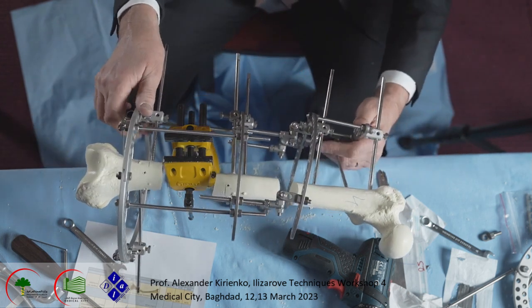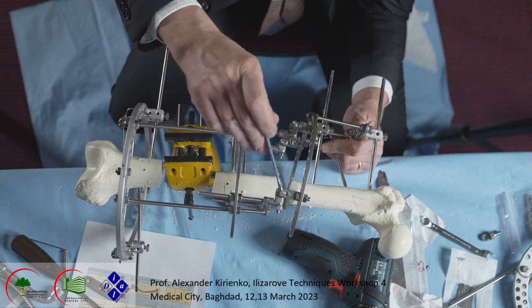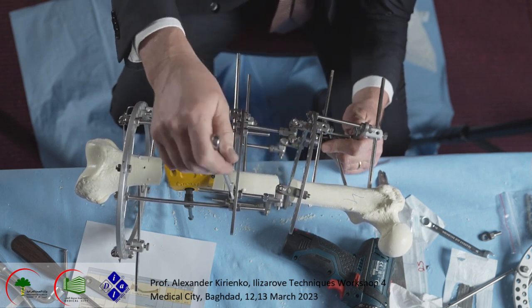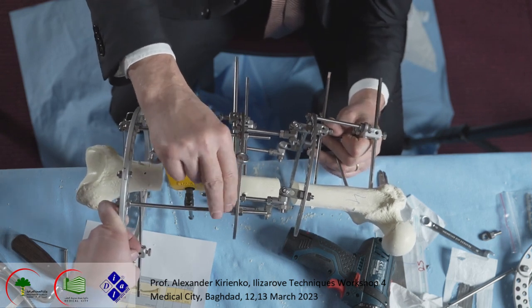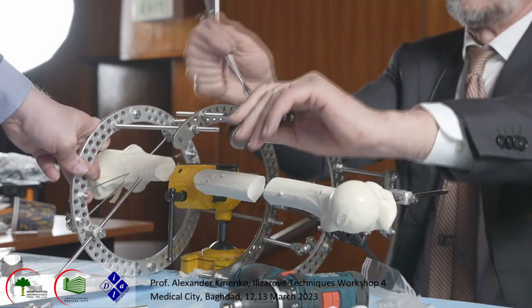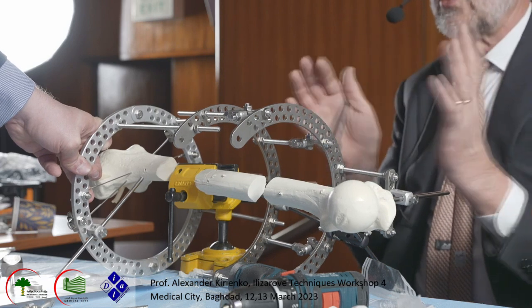And when we finish lengthening, practically we stay firmly with this medial rod, these hinges work, and we may do a little bit more distraction of this rod for correction, but it's better to achieve as much lengthening as possible, and when regenerate starts forming, there is no shortening.